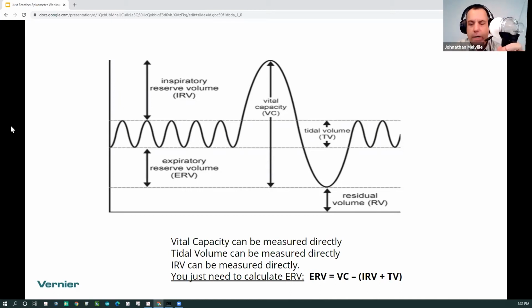If you rest your elbows on the table and hold it at mouth level, that's really good. And the key thing is you want to zero it in the position that it's going to be used. The number one factor that we see with students when you get bad data typically is they zero it when it's on the bench. That's right, they've got everything set up right here. They go to calibrate, they go to zero the flow rate, and then they pick it up.